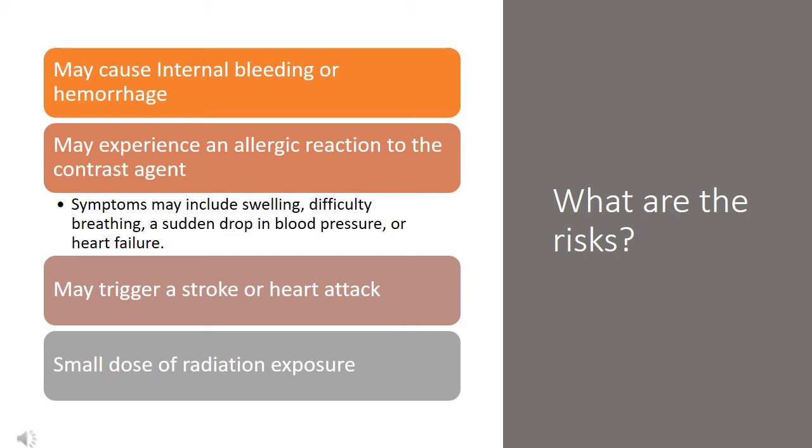Most people won't experience any complications. However, there is a small chance that any of the following may occur. Since the procedure involves piercing an artery, internal bleeding or hemorrhage are possible complications.